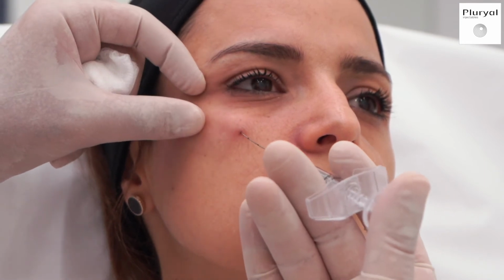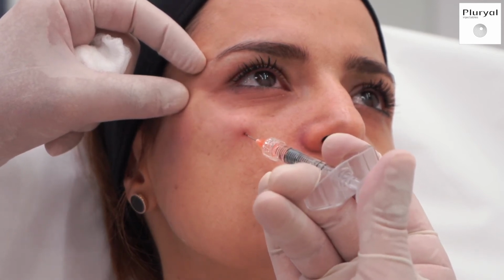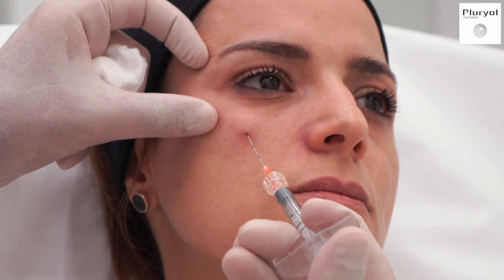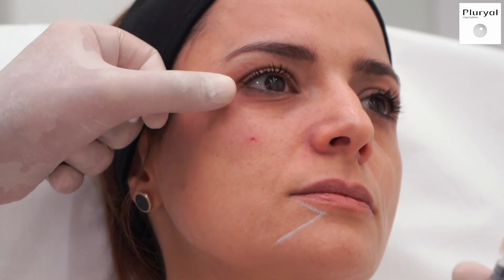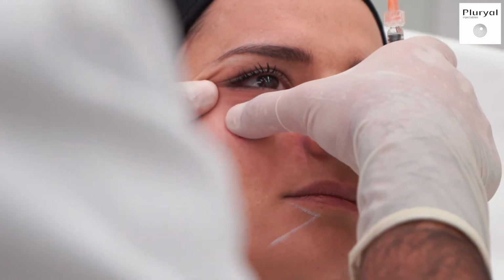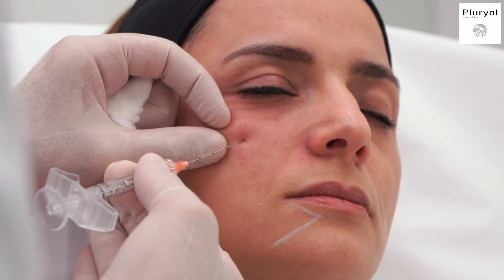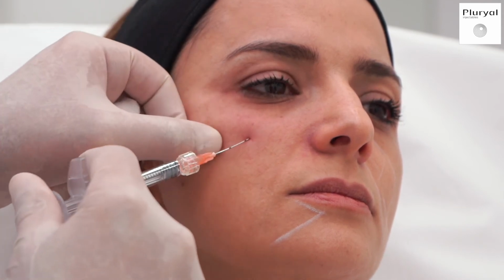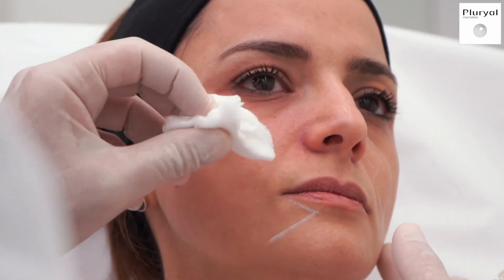I always remove the cannula, check where needs to be filled more. And we're done with under the eye area.